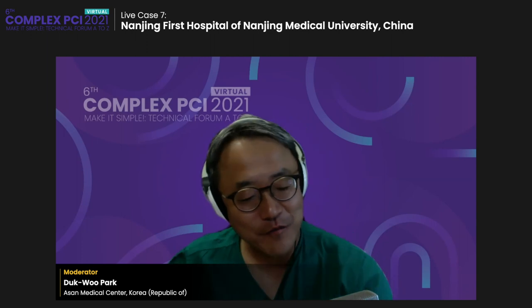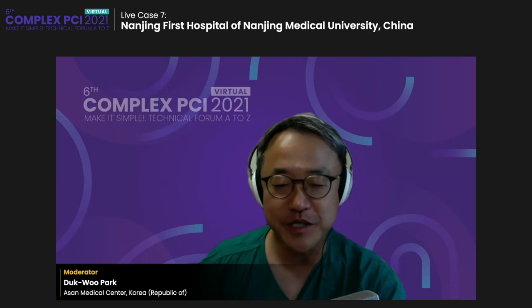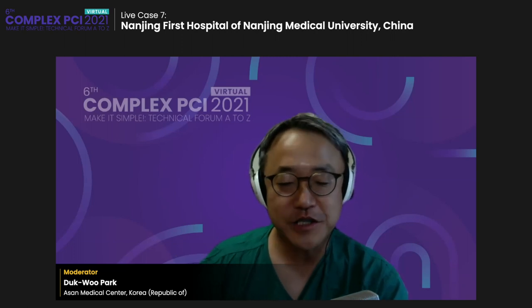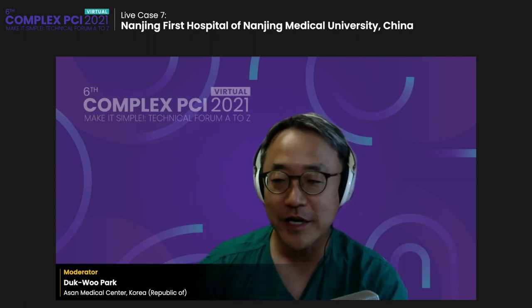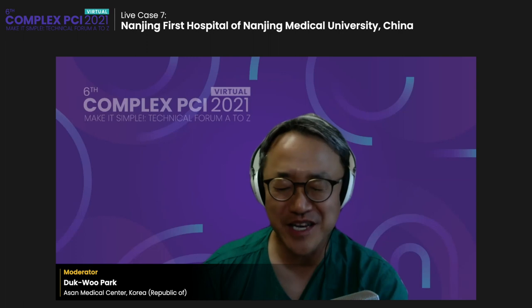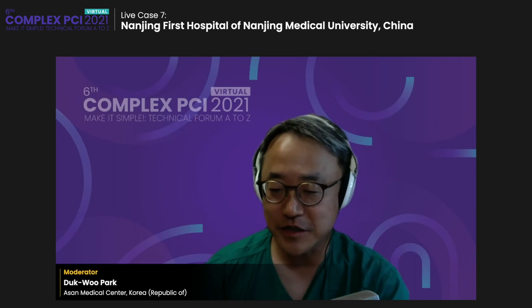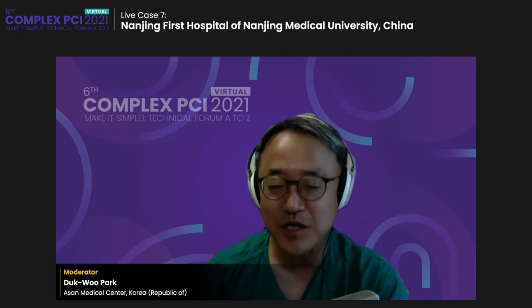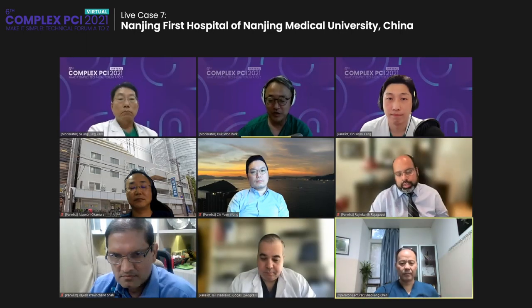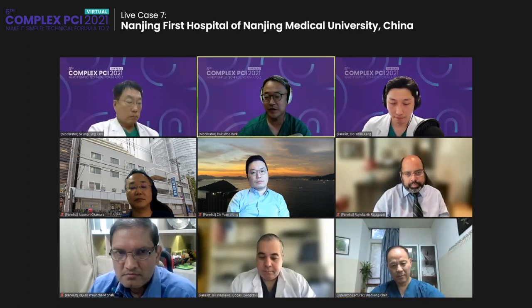So I'd like a final question to Dr. Shao-Liang Chen. Recently, the EBC main result is for looking at the distal left main bifurcation region. Two large randomized trials available are the DK crush 5 trial and the EBC main trial. The two trials' inclusion indications are nearly the same, but the final results are somewhat different, conflicting. One says two stents would be okay, better than provisional. The EBC main says provisional would also be okay compared to double stenting. How can you interpret this in real-world contemporary clinical practice? How do you think about that?